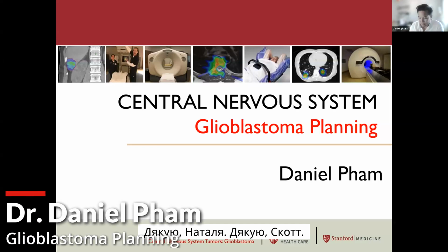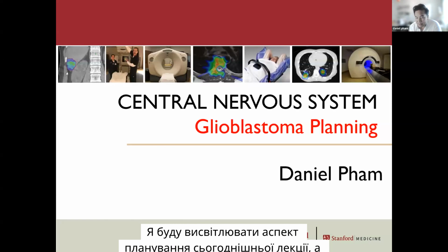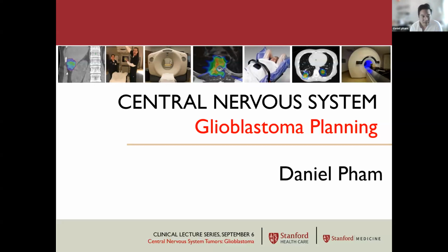Natalia. Thank you, Scott. We'll be covering the planning aspect of the lecture today, and I do want to state that the planning that I'll be talking about will be from the perspective of how we've been doing at Stanford here.